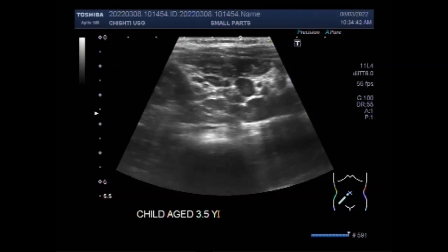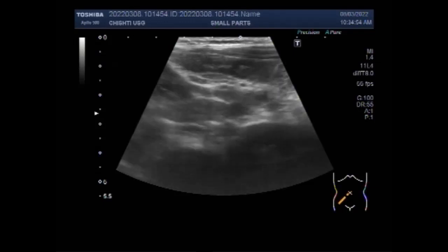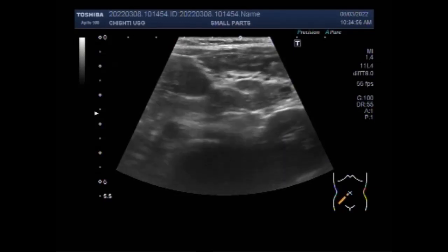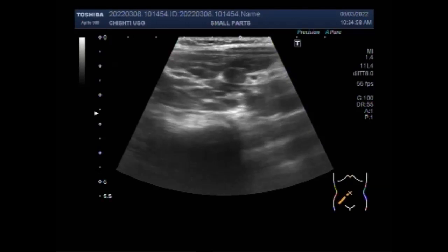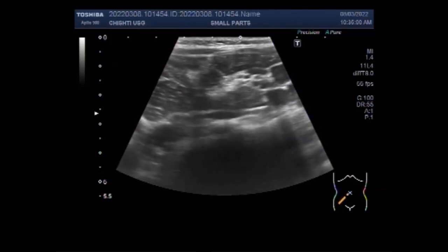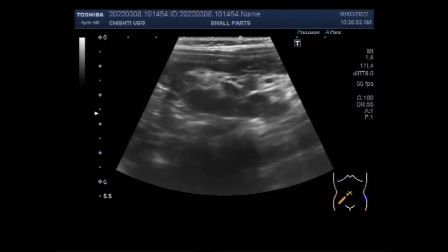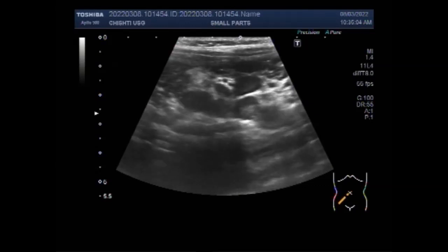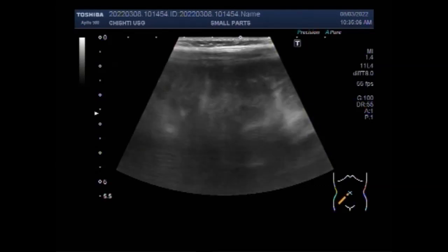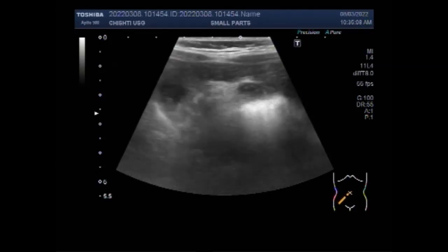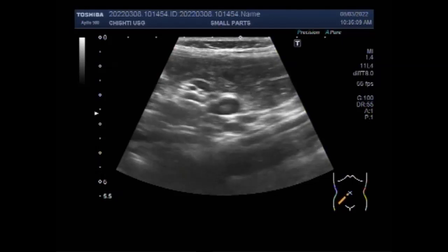Now you can see the area of scanning is the right iliac fossa, and multiple prominent lymph nodes are seen in this area. Sonography of normal mesenteric lymph nodes shows that they are oval with a prominent fatty hilum. You can see the enlarged mesenteric lymph nodes.